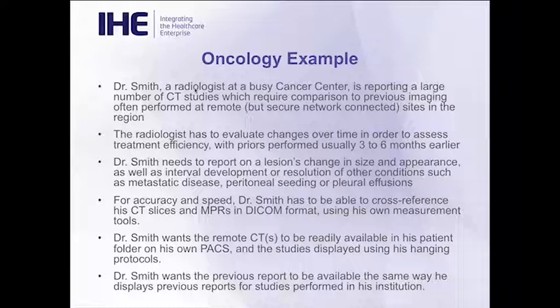and we have to be able to have a faster turnaround time for our report. One of the issues with CDs, very often they go to what is the film library now, and they have to be imported in the PACS, and in our organization, for instance, can take up to 2 to 3 days, which is unacceptable. So we want to have access to the images timely.